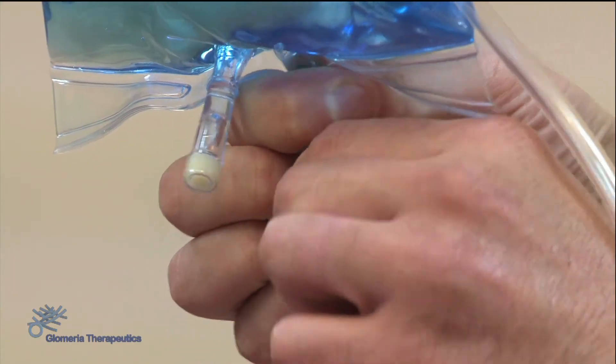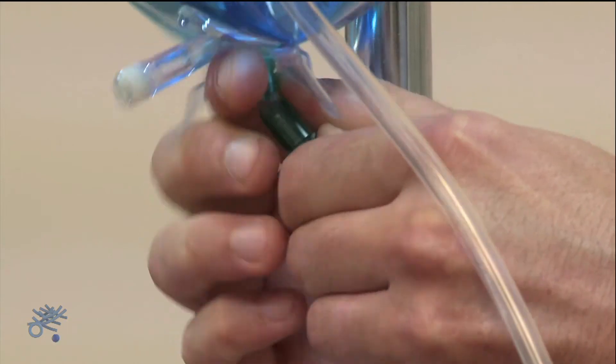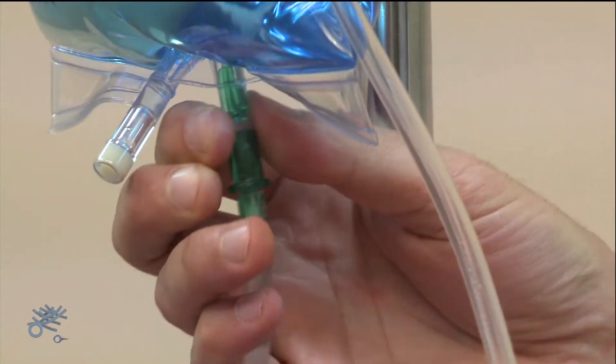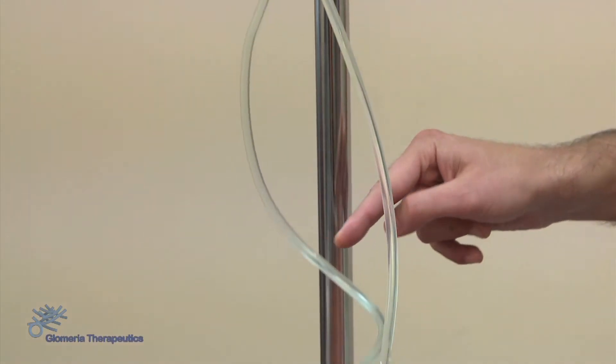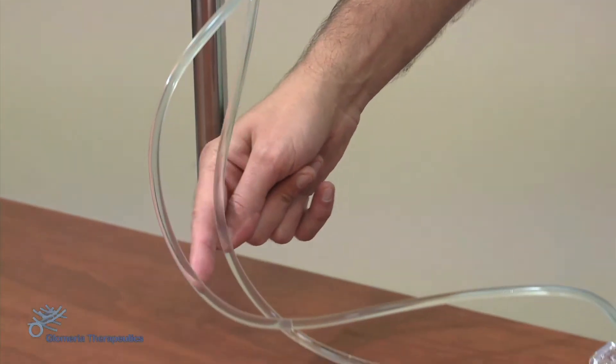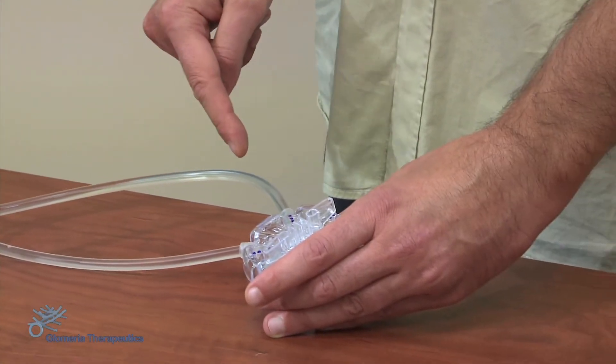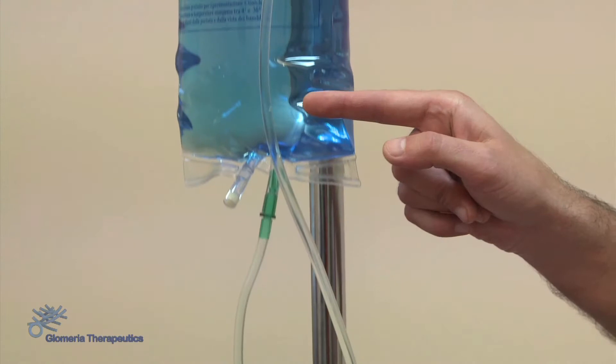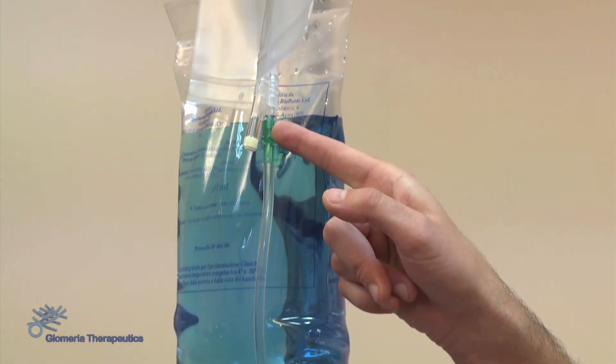Now we can manually break the cone on the empty bag, repeating the movement to be sure of its rupture. The solution now flows freely in the lines, moving towards the empty bag and pushing into it any potential air bubbles present in the tubes.